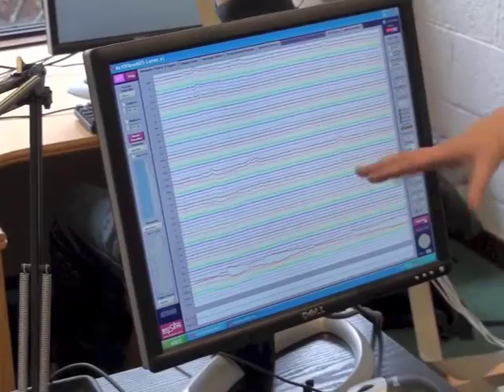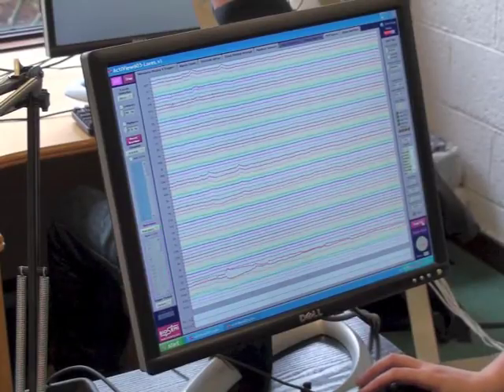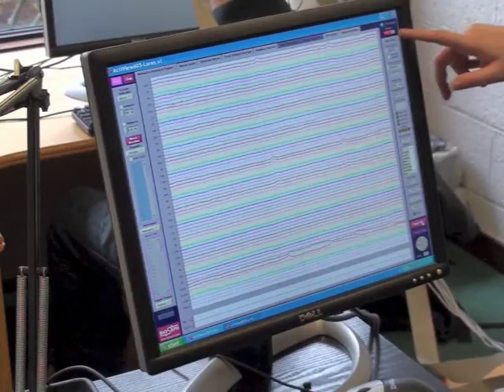You just click through all the things it says, warning, blah, blah, blah. That doesn't mean anything, that's fine. Other things that are useful to know is CM in range just means everything's connected fine, and how much battery life you have left to give you a bit of a warning.